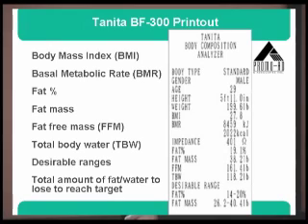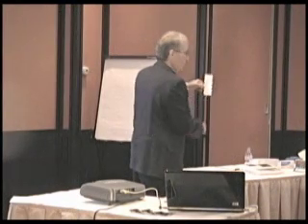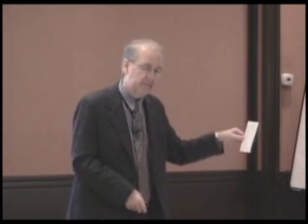In terms of fat percentage, it calculates that. Fat mass in terms of pounds, how much actual fat there is. Fat-free mass, so other than fat. Total body water, and then the desirable ranges. And this particular reading is a little bit different than what the machine's giving up to the bottom here. So what Ryan's got on his readout is a target body fat percentage, and he's inputted 23%, as we said. Predicted weight, it says, is 180.6 pounds. So by predicted, it means what his target would be if indeed he was to reach his ideal body fat percentage. So 180.6 pounds. Predicted fat mass, again, what it would be, 41.6 pounds if he was to meet his ideal body fat mass. And he's actually got body fat to gain.